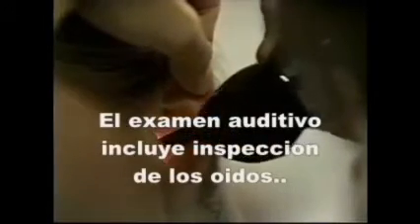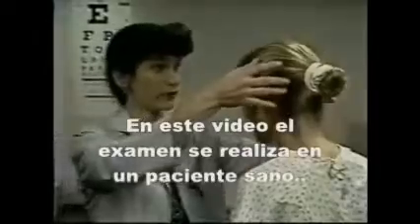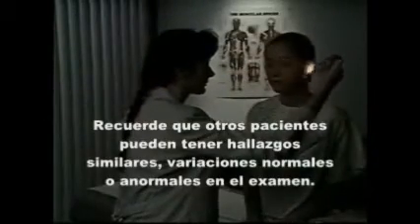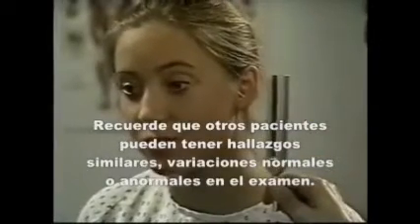including inspection of the ears, otoscopic examination, and tests for hearing. In this video, the examiner will assess a healthy patient. Keep in mind that other patients may have the same normal findings or may exhibit normal variations or abnormal findings.